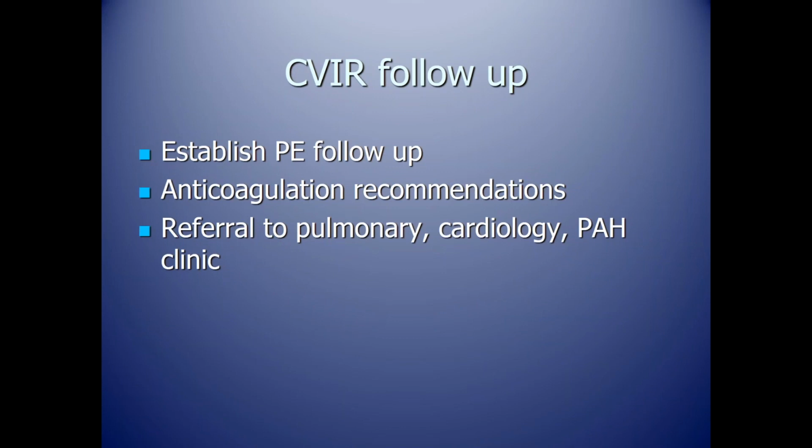But if you've given them the treatment that you feel, and I feel has been established to be pretty safe and effective, you've given them the treatment. And continuing thrombolytic therapy may just now raise your incidence of having bleeding complications. TPA, even though we do stop it at 12 hours after the procedure, does bind to the clot. And so even though you're going to stop the infusion, you are going to have some benefit of TPA over the next several hours. And so that's why some people will see significant decrease in the pressures when you do follow-up pressure measurements even the next morning.